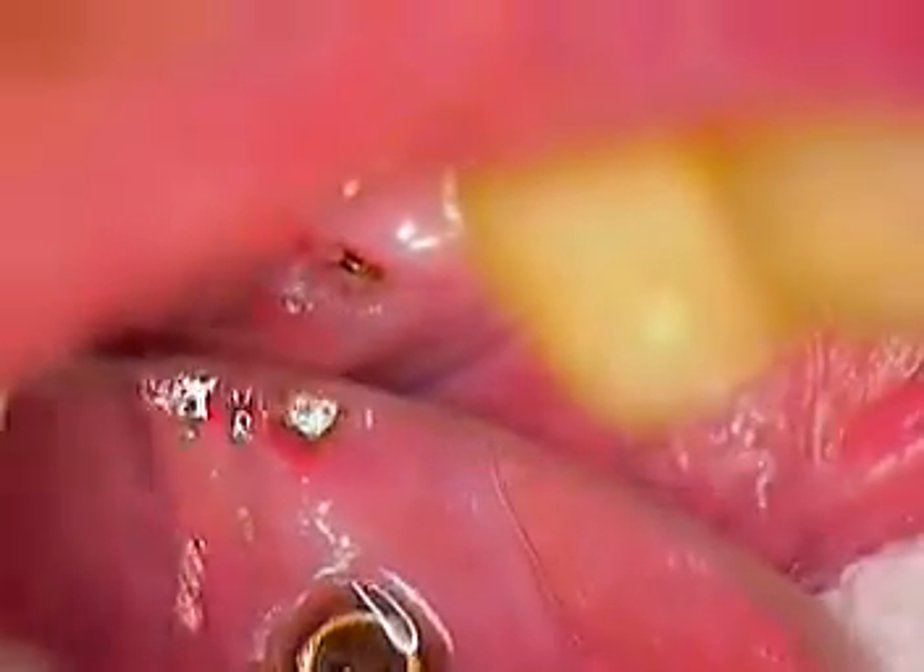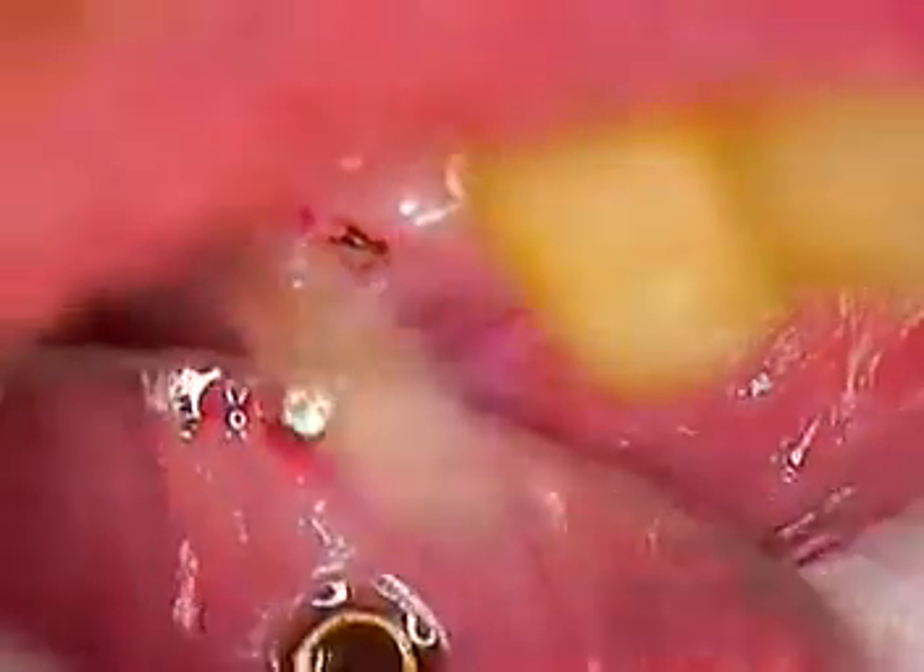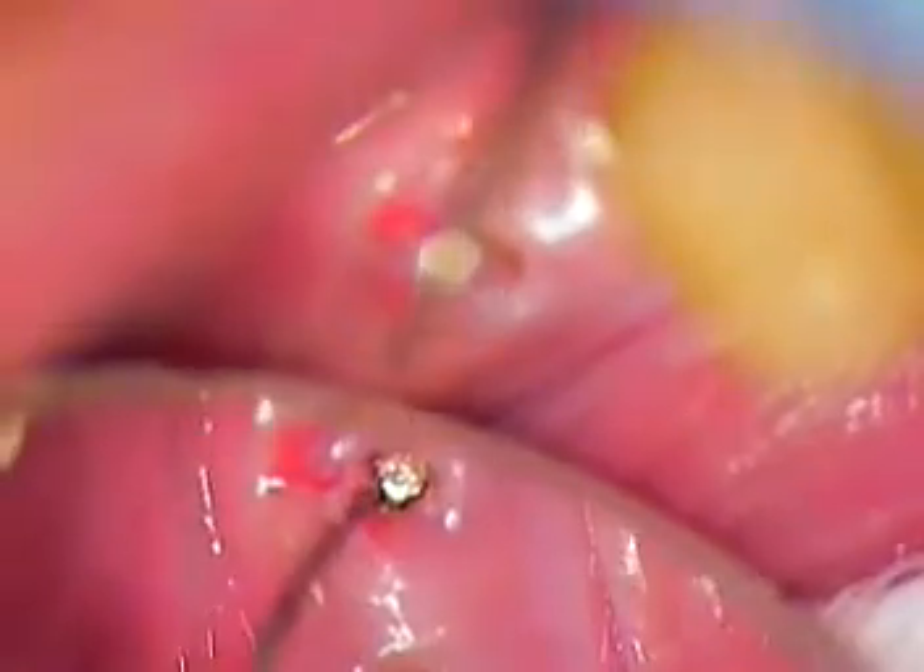I'm going to continue working here. I'll work for the next five to ten minutes on filming, and then we'll take a break and give Larry a little break too. We're almost through. This one is coming out nicely. We had a little tissue gingival complex growth around the margins of the implant head — the hex head — so we'll push that back. We've got retraction cord and all kinds of stuff we can use today before we put something in there for him. This one is actually a lot easier to remove.